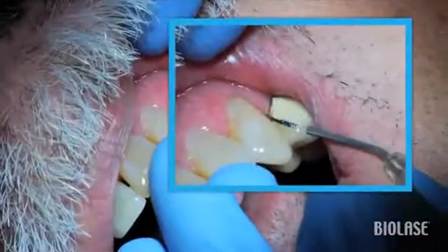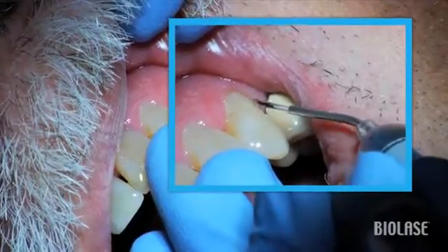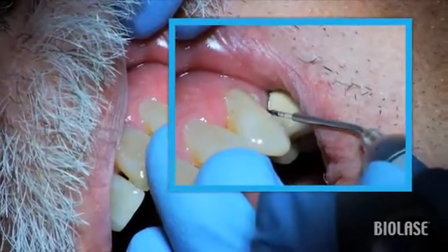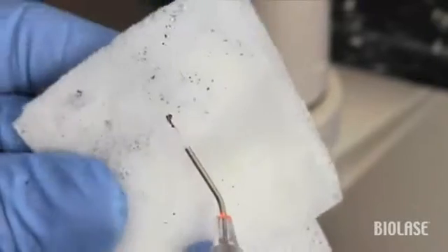In this view, you can see the zigzag technique again. Normally, one or two laser passes should be sufficient for good tissue removal. You will be looking for tissue at the end of the tip, as well as reduction in bleeding or inflammation when present. Gently wipe the fiber as needed throughout the procedure.